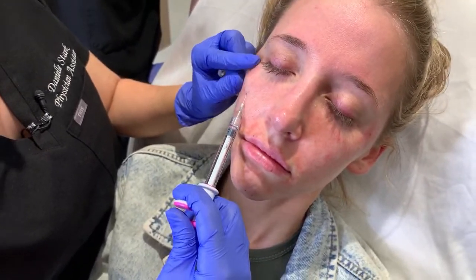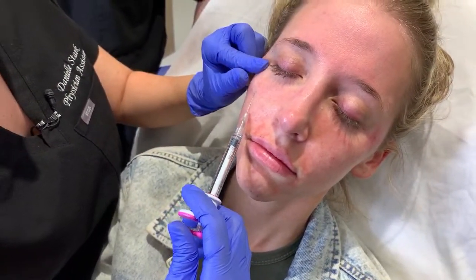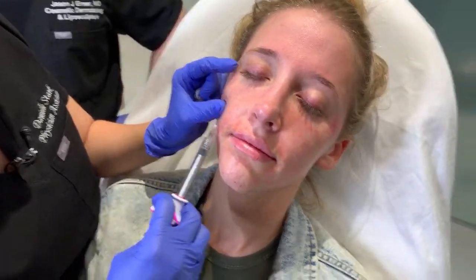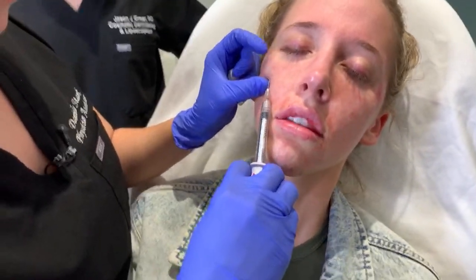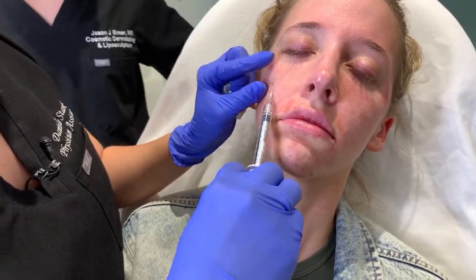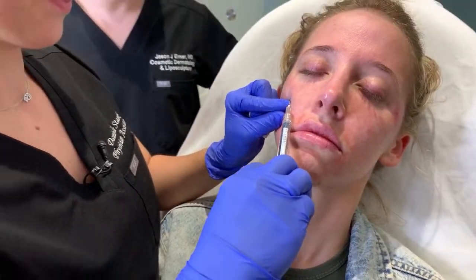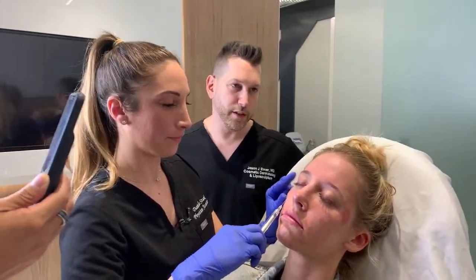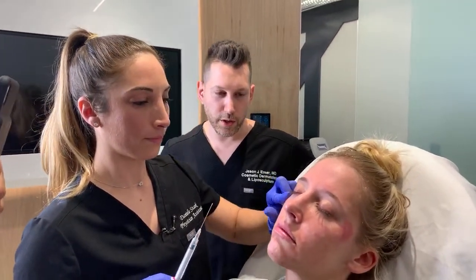So we put filler right here to support the side of the eye, to smoothen out the transition between trough and cheekbone. And that's understanding anatomy. I call that anatomical filling or dimensional contouring. You're doing it in 3 dimensions, or a different shaping, so that it's blended. It's not just a chisel. It actually looks more natural.